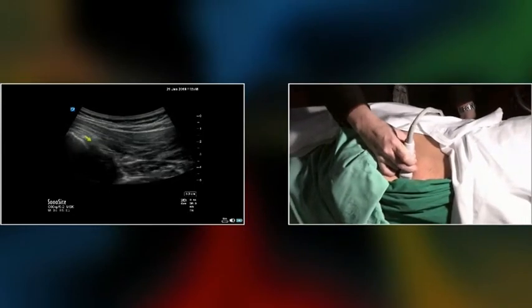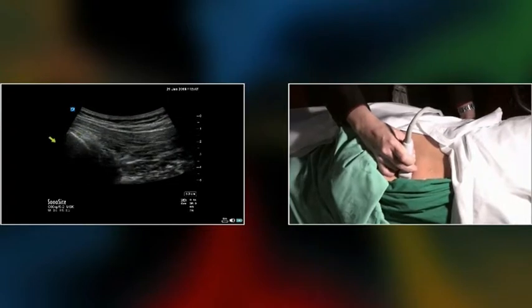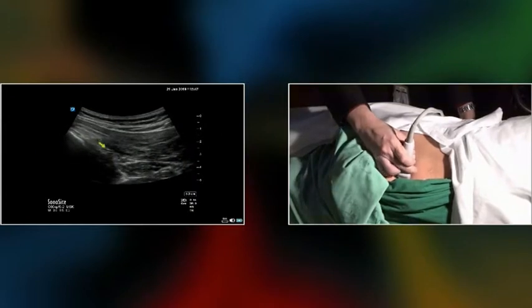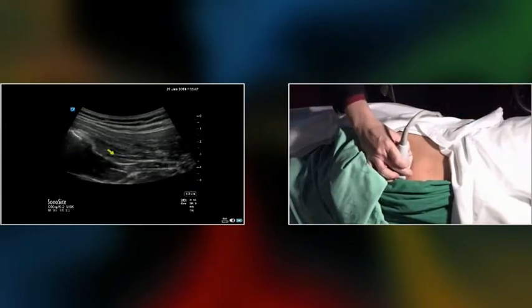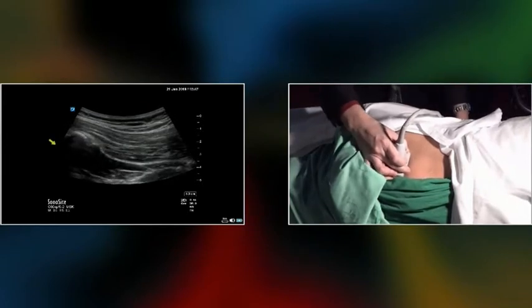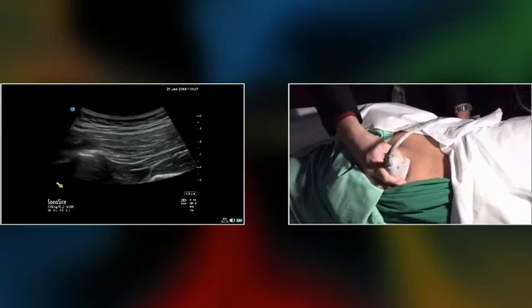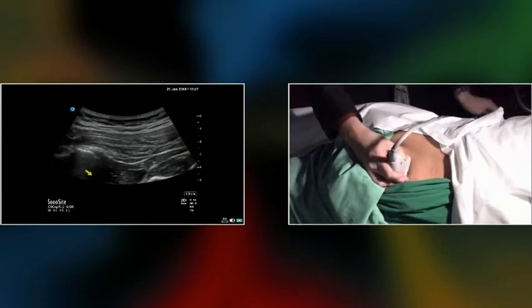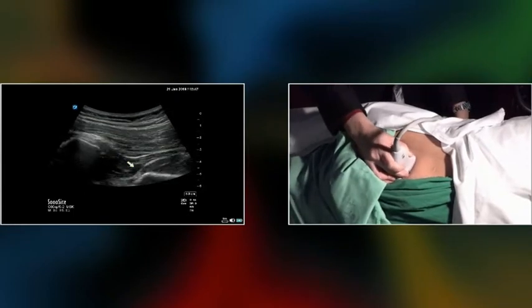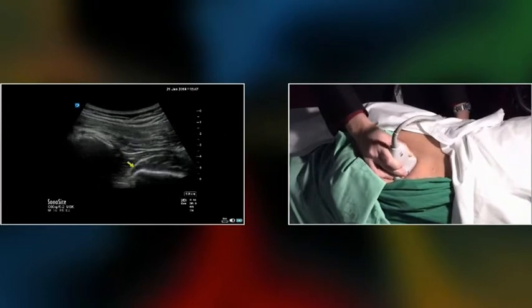Yep, looks like it's got the break here. The thing is, there is some tiny movement here. It's like a secret, because the hole is not like this. It's tilted a little bit. So if you want to dig into the hole, you have to move the probe lateral and turn a little bit medial. And then can we go a little deeper? And then tilt to the direction of the piriformis muscle.